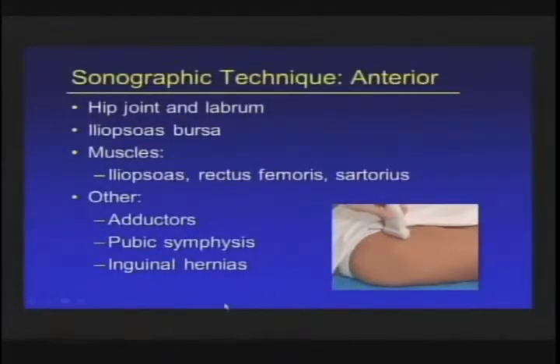Now, inguinal hernias is a separate exam in itself. There are some indications where you need to perform a separate hernia exam. Most people feel that the sportsman's hernia, however, is related to a tendon problem rather than a true hernia.